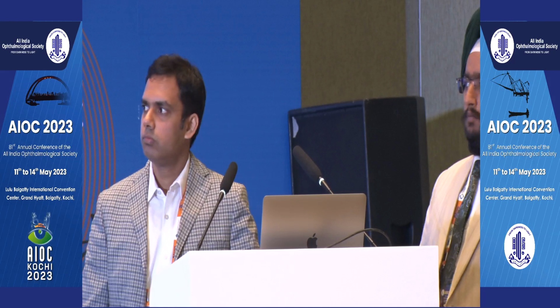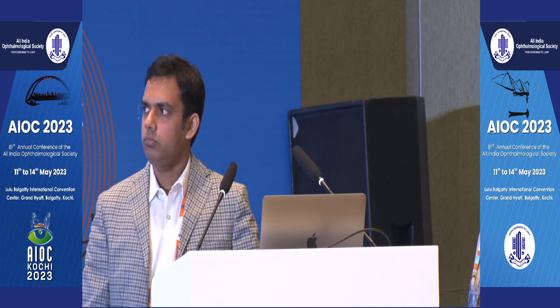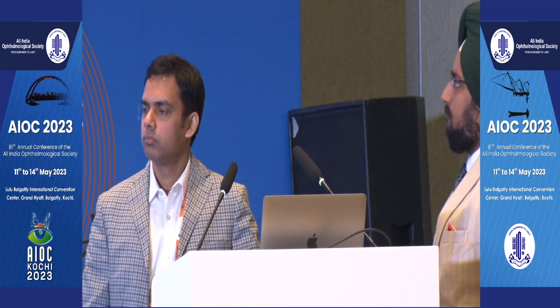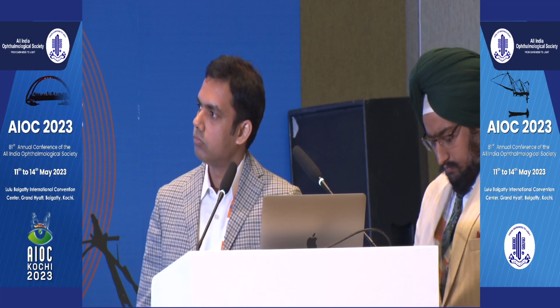I think one important point is to differentiate between hypotony-related globe collapse, which you can get because of infusion and outflow mismatch, versus just a localized infusion cannula related choroidal detachment. With hypotony from infusion outflow mismatch, there'll be a 360-degree, almost like a globe collapse, which all of us who have done vitreous surgery understand.